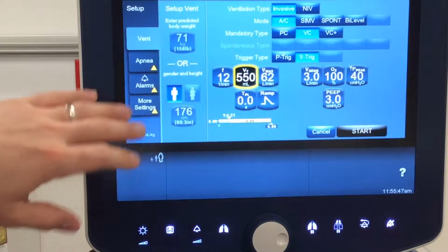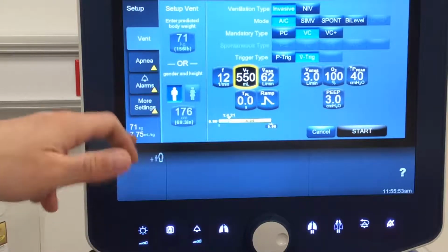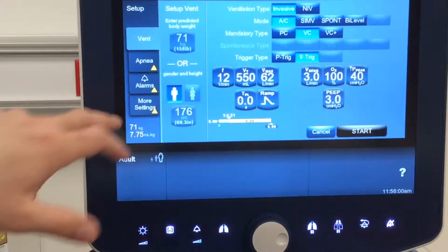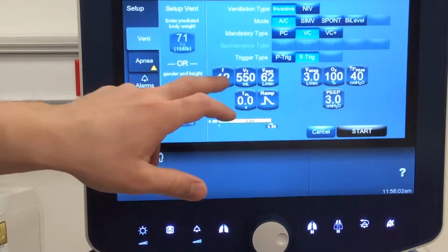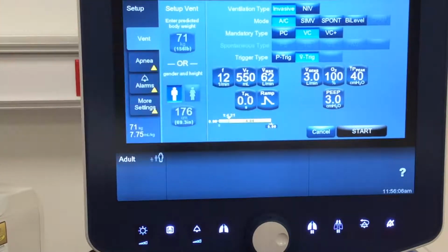It helps us dictate how we're changing ventilation as we get into the more meaty core concept stuff a little bit later on. Most of our patients, we're going to initiate ventilation somewhere in that 6 to 8 mils per kilo range, but we could go down as low as 4 mils per kilo if something wrong were happening. Okay, so respiratory rate of 12, a tidal volume of 550.